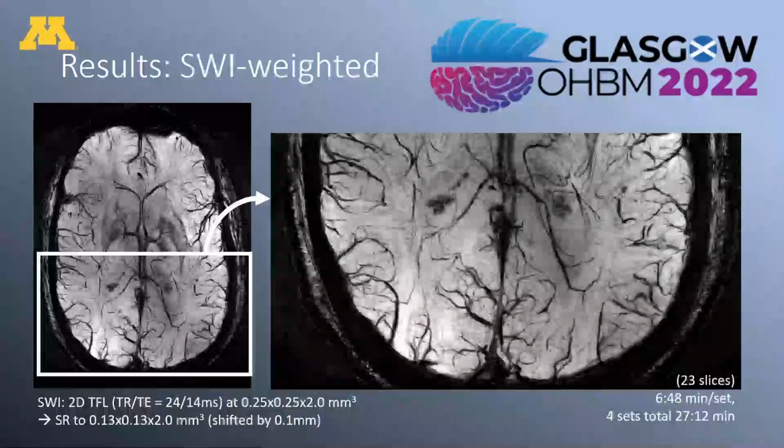With SWI, it was interesting. I tried to acquire from the same location, but the sequence is a little different. But yeah, you do see a lot more details with the high resolution.